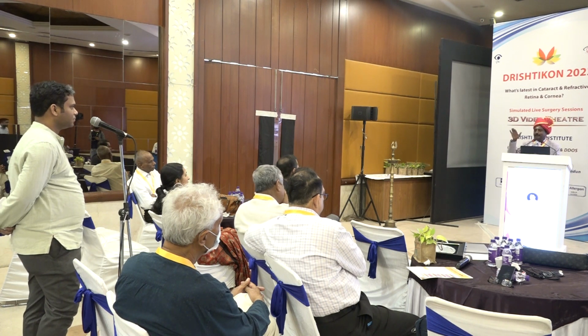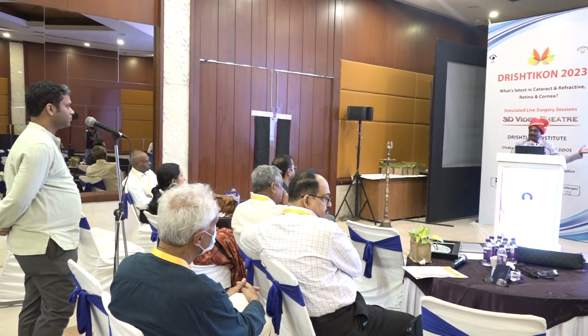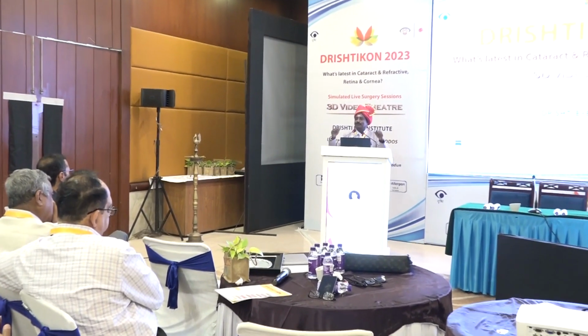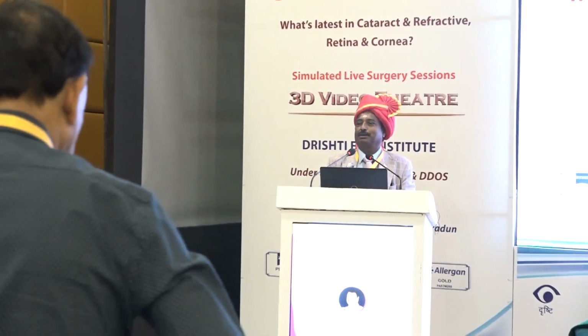I said, we reattach the retina on the table, so no need for positioning the patient. Still, I use a non-expandable gas just for volume, so that you don't have to tighten the buckle, because under the air, scleral rigidity will change. So moderate buckle is good.